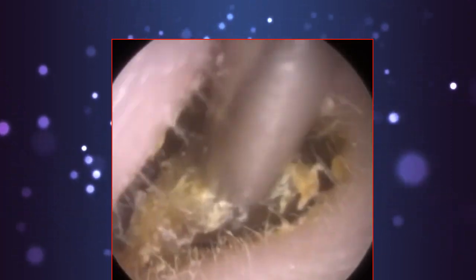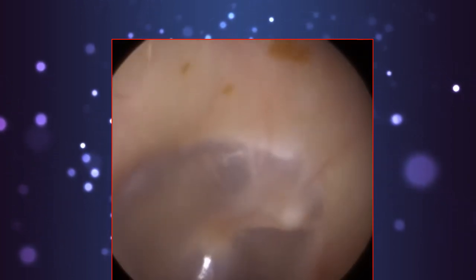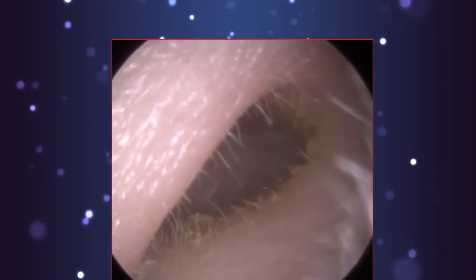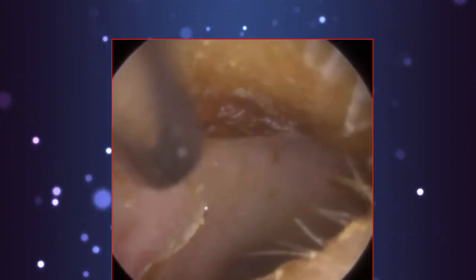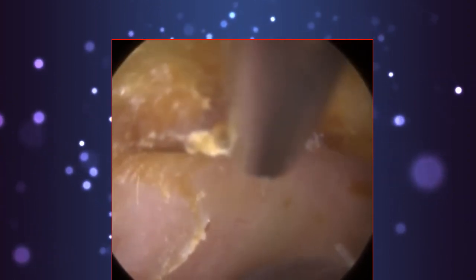So you get different grades, different levels of otitis externa. I've kind of almost simplified them. Generally it's termed superficial otitis externa. That's when it's just the surface of the ear canal that's got a bit of dry skin, eczema, psoriasis, just like in this patient. And theirs is more lateral, so you can see I've taken that dry piece of hard wax out of the ear using suction. You can get deep otitis externa. Deep otitis externa is when you get a bit of inflammation, a bit of swelling in the ear canal. Then you can get more severe cases of otitis externa.